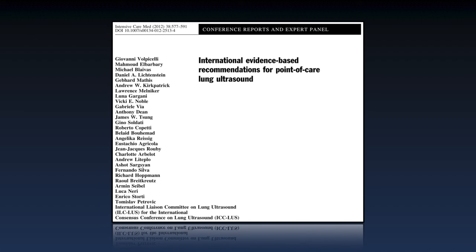And our job as physicians is to take the data that we're seeing on our lung ultrasound and marry that up with the clinical presentation of the patient. And then ask ourselves some very nuanced and subtle questions, which we'll get into in a little bit, to help us tease out, okay, if the Venn diagram has overlap, am I on the left side of the diagram or the right side? Am I leaning towards maybe a pneumonia, or am I leaning towards atelectasis? Am I leaning towards a pulmonary contusion, or am I leaning towards pulmonary fibrosis? Things like that.